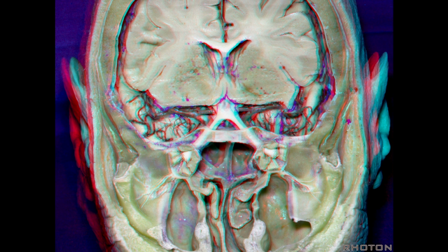And as you look into the nasal cavity, the biggest obstacle to getting into the sphenoid sinus near the midline is the posterior part of the middle turbinate. It bulges over, and it tends to deflect the speculum to the opposite side. And if you get caught on this crest on the face of the sphenoid and open the speculum, it's a little more than 1 centimeter over to that optic nerve and the optic canal.